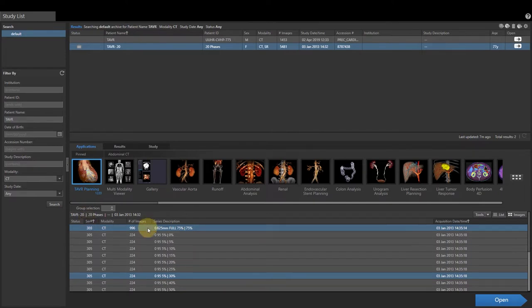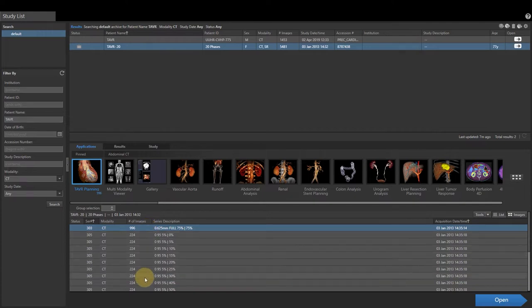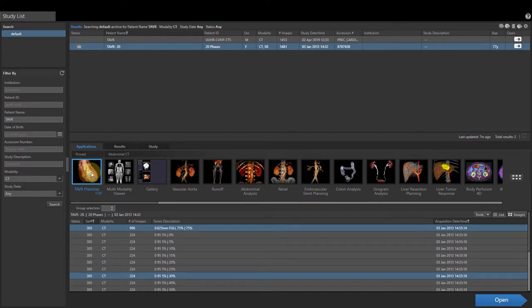Then left-click to select the series to load into the application. Hold CTRL to select multiple items. Then click the OPEN button at the bottom right-hand corner of the screen, or double-click the TAVR planning application to launch.